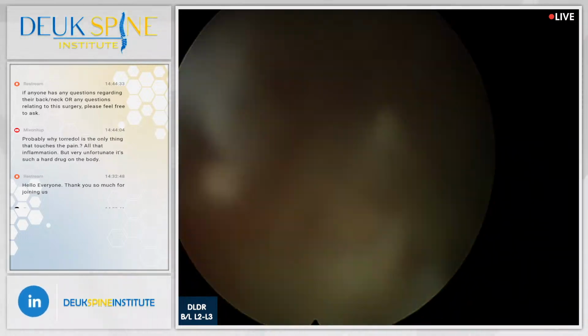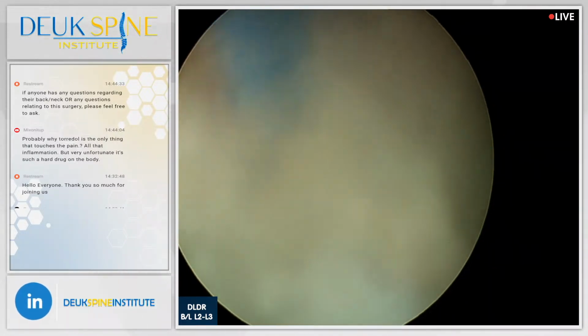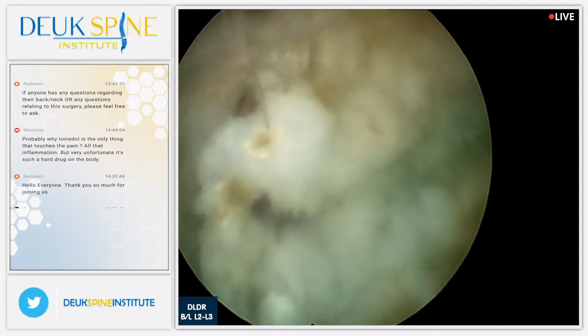Guys, what's going on with my irrigation? Get it fixed, please. Thanks.